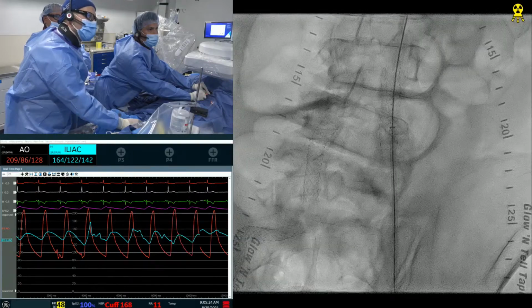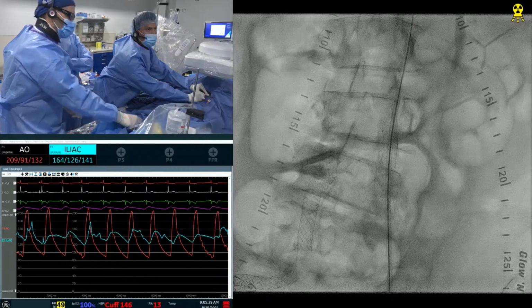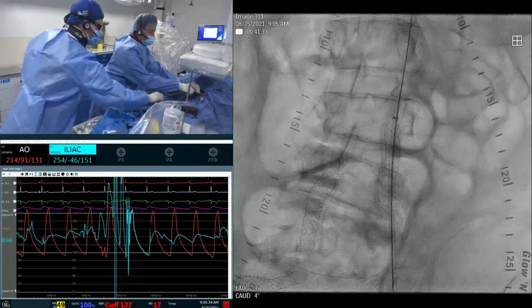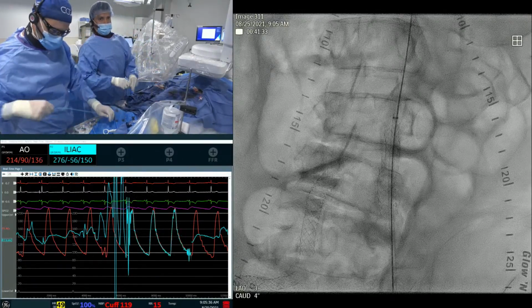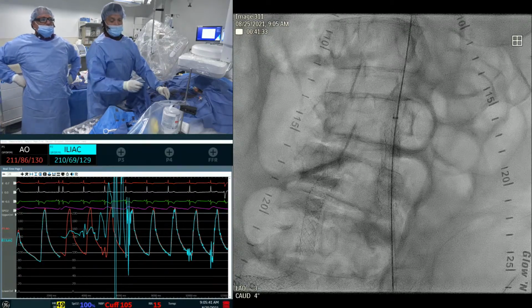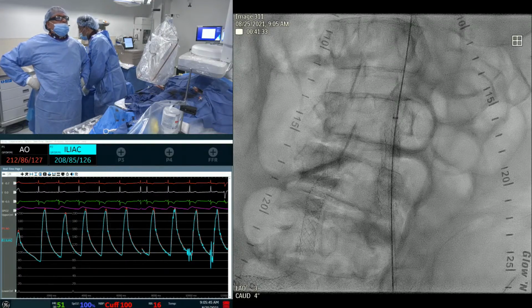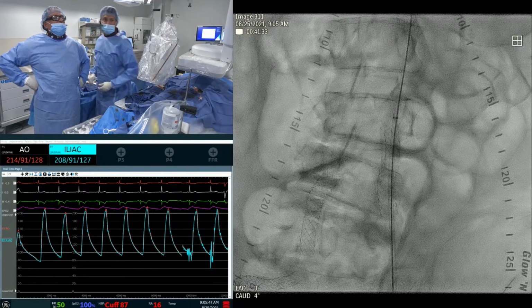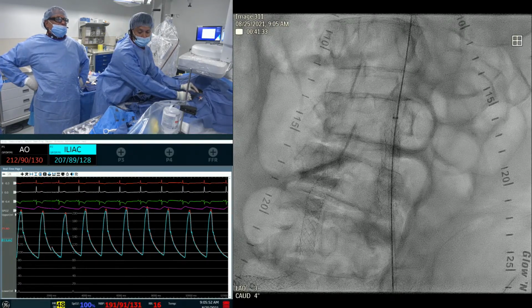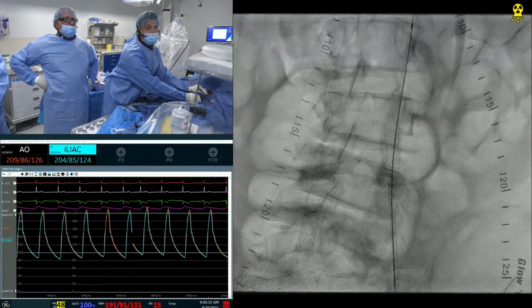He's going to go right in all the way to the aorta, and then from the aorta, we will take it down. Good. Now we'll start from the aorta. Also passing through without much of an issue is very optimistic. That's an excellent point. So you can see, I think the issue is not that sac, right? The issue is the ostium, and also the gradient. I think it is the external iliac gradient. So that's what we are worried about. Well, this will tell us right here. Just come slowly. So record, guys. There's no difference here. So nothing in the ostium.